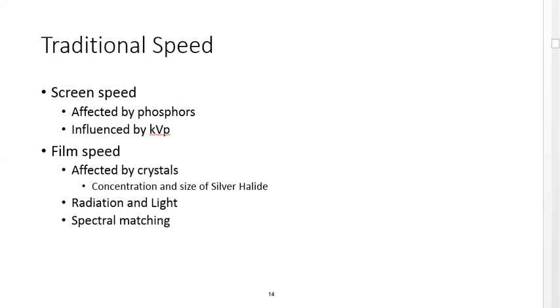So even if you're shooting an X-ray beam with 110 kVp or 100 kVp, let's say, the average energy is only going to be about 33 kVp. So the average X-ray photon would not eject the inner shell electron from the tungstate portion of a calcium tungstate atom in a screen. All the electron shells could not be ejected by the average energy of a normal X-ray beam.